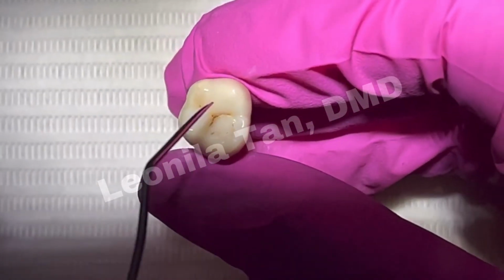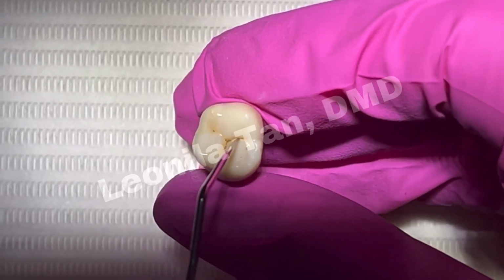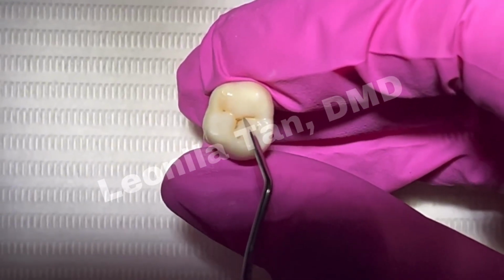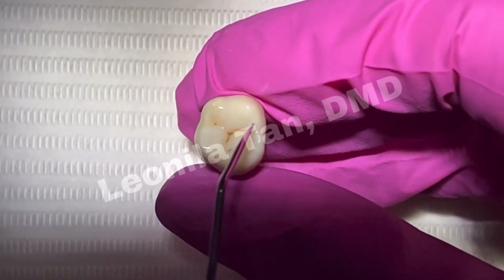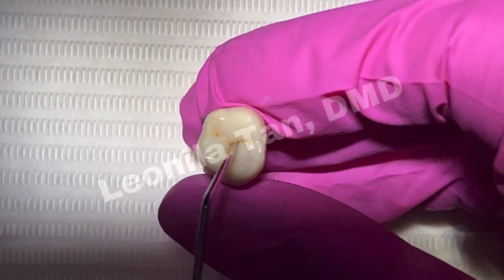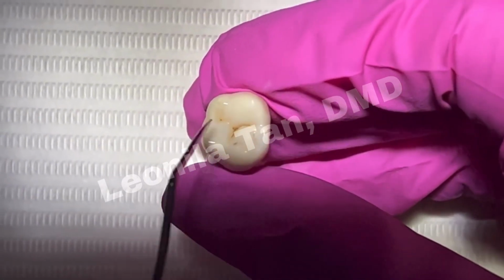And if we are using this explorer as the orientation of the burr, it's always directed facing towards the palatal. It's never directed going to the mesial, or it's never directed pointing distal. Burr is always slightly angulated, directed towards the palatal. Why the palatal? Because that is where you have the biggest part of the chamber, and where you also have the biggest root or the biggest canal, which is the palatal. So why should it be directed there?